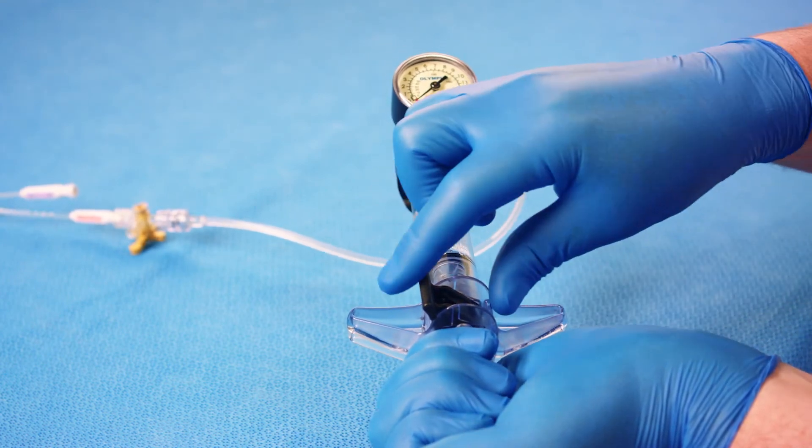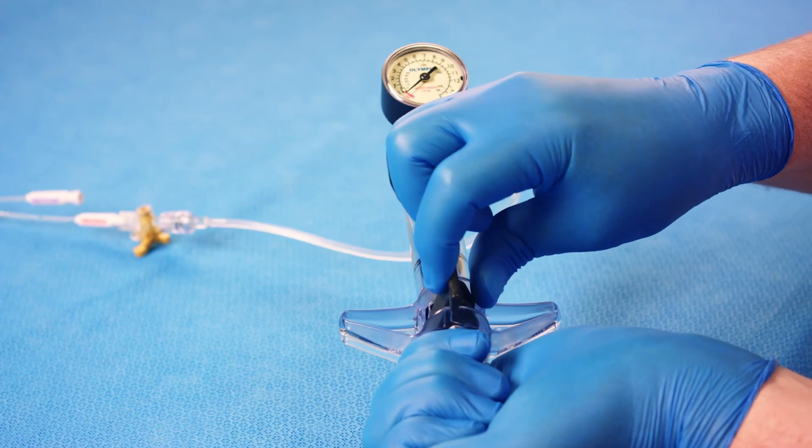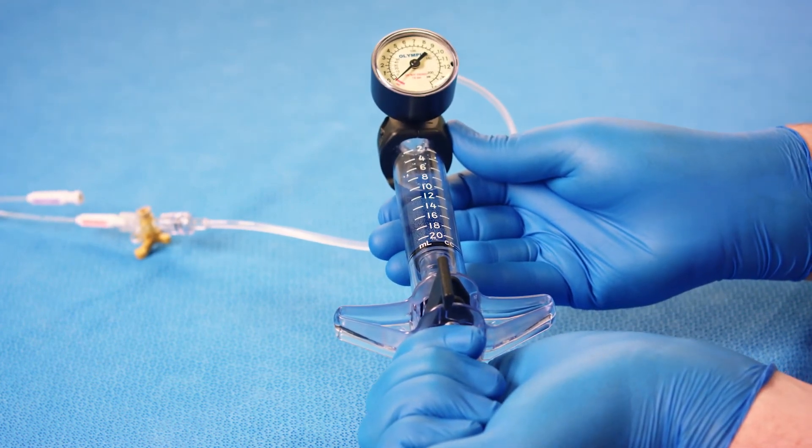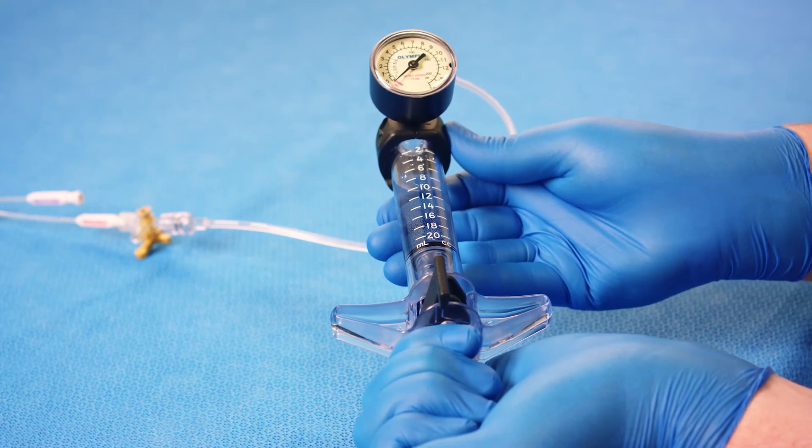With your free hand, turn the locking switch back into the center position. This will lock the plunger in place and keep the balloon in continuous vacuum.